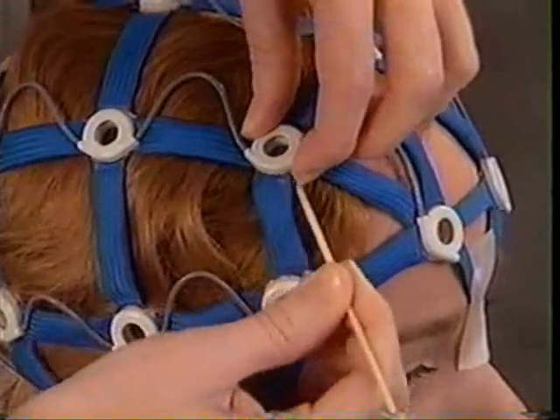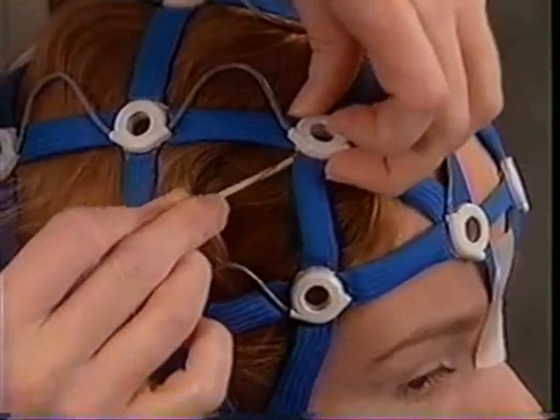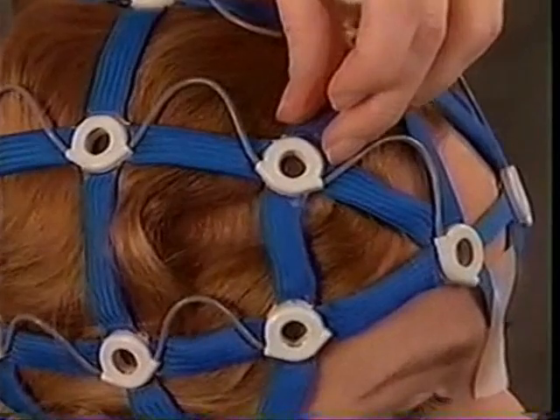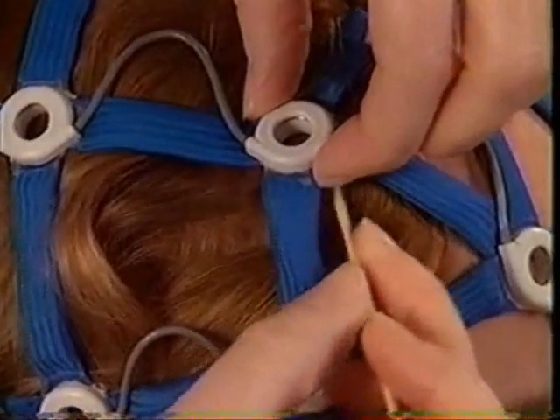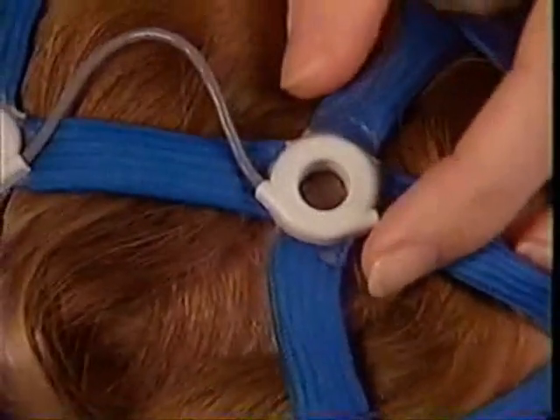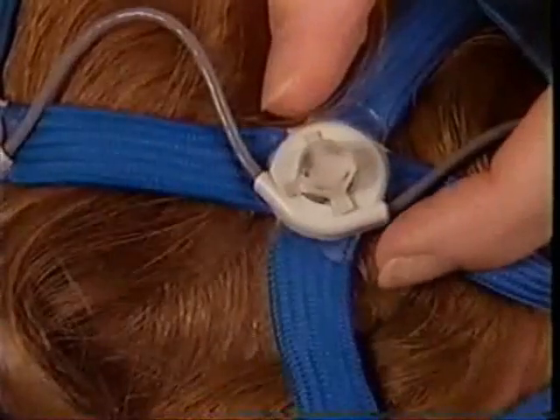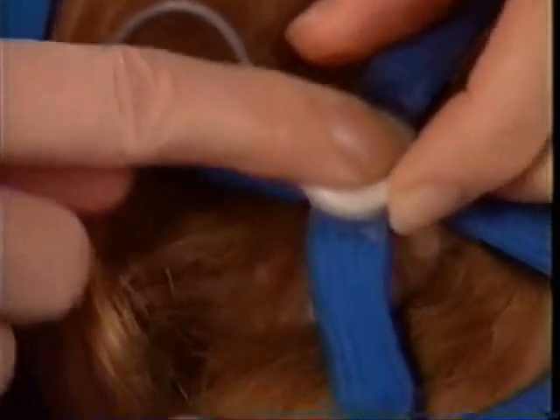For very long hair, do not pull the hair through the Enet sections. Just tilt the socket slightly and part the hair away from the center of the socket. Tilt the socket, prep the scalp, and sweep the hair back as you remove the swab. Insert a biosensor, tilting the socket slightly for leverage as you push it in. Press the biosensor slightly to assure contact.